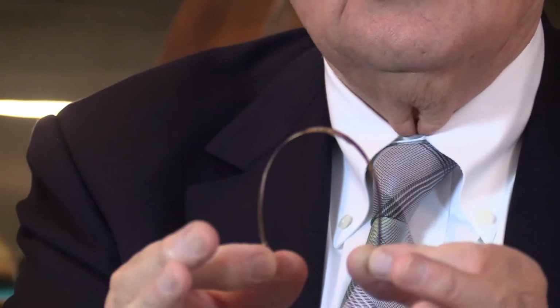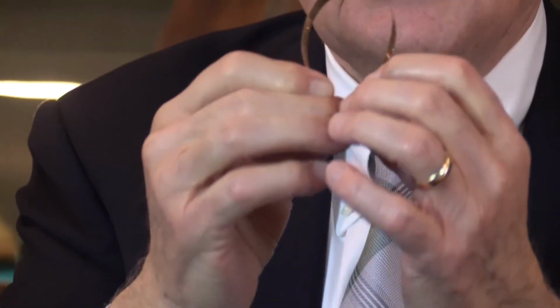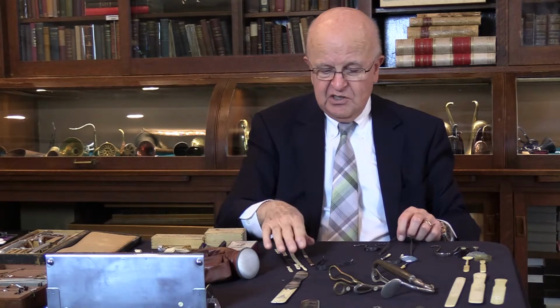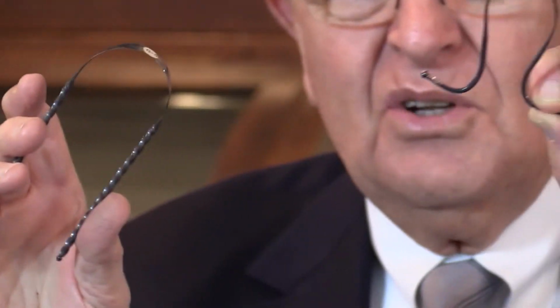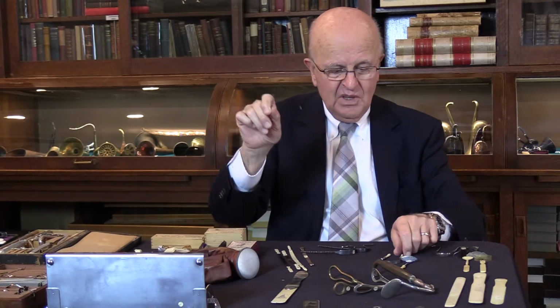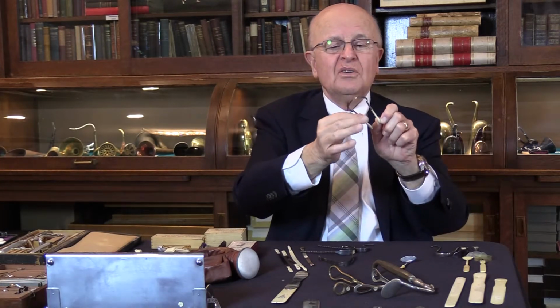This is an interesting one. This is gold. Gold, I can do it here. See how it becomes this shape like a horseshoe to scrape the tongue. Then instead of having the straight ones, they started coming up with this kind. This is silver here. This is another silver here. Same thing here. This is an older one.